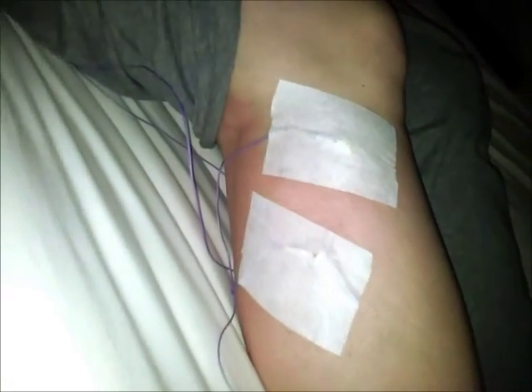Hi! I'm all hooked up. I don't know if you can see me. And I have them in my head, in my hair. I don't know if you can see that. And then this is for snoring and noise while I don't have my CPAP on. He said they'll take that off when I put my CPAP on later. And then here's all the cords that go to his computer. And I have a thing on my finger and this stuff around my waist. And then a couple of things on my legs, on both legs, I guess.